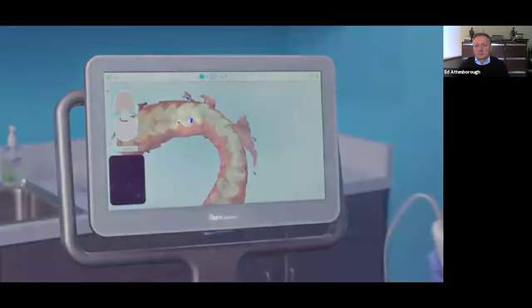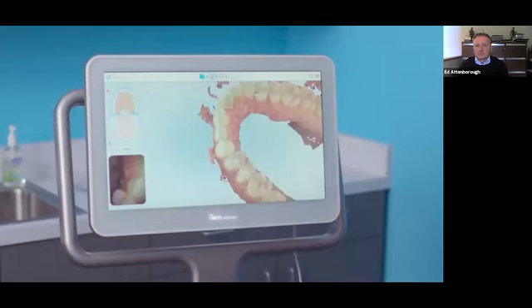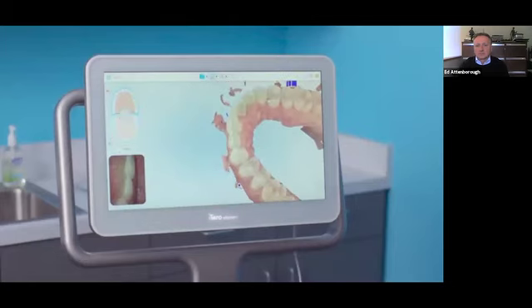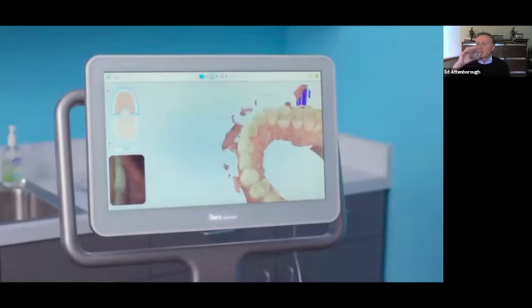I use the marks to guide me to fill areas of missing anatomy. Missing anatomy alerted by the red and purple marks needs to be filled no matter how small an area. However, holes without red or purple do not need to be filled no matter how large.